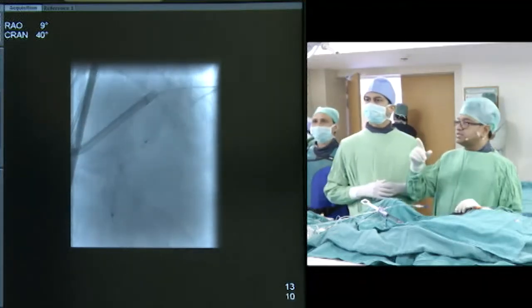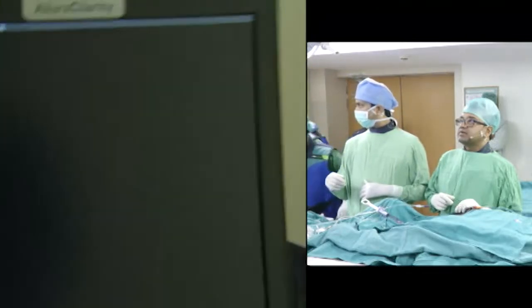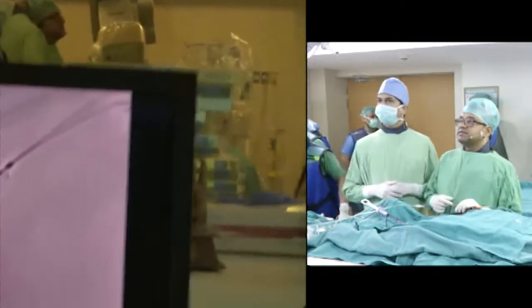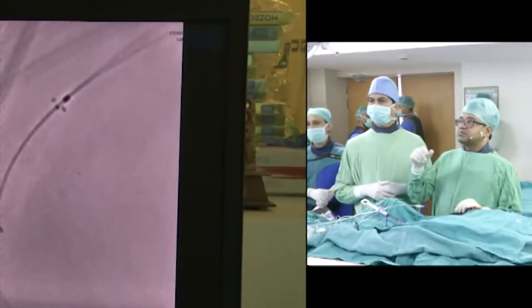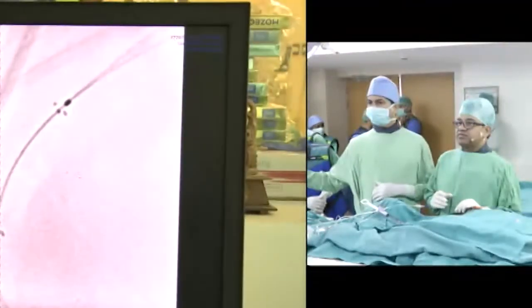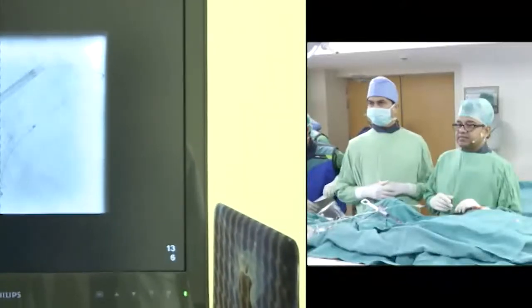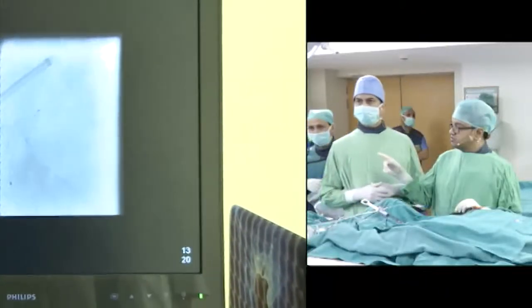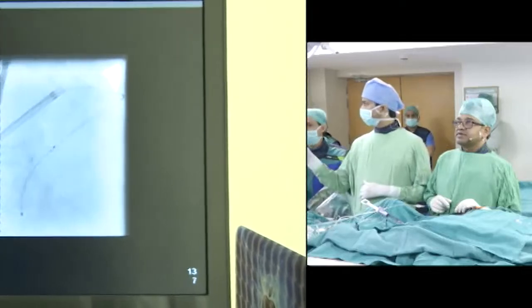I hope you can see the stent boost images. Just proximal to the balloon marker, you could see the 3 scaffold markers, 3 in the proximal segment and 3 in the distal segment. This is unique and different from the previously existing absorbable scaffold. We were able to see that a little bit. Can you show the stent boost images?